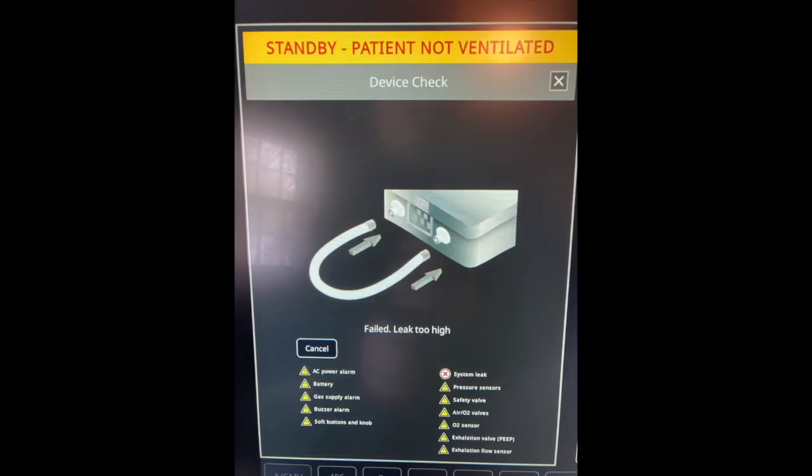In this video, I'll be performing a leak test under the service menu to identify which side my leak is on, my inspiratory side or expiratory side.